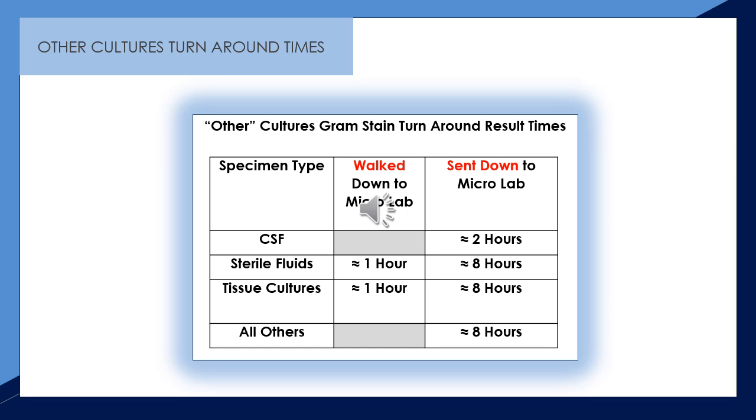Other cultures turnaround times. This slide is provided as a reference for other cultures' gram stain turnaround result times. Please note that specimens that are walked down to the microbiology lab typically have a faster turnaround result time than specimens that are sent down to the microbiology lab.